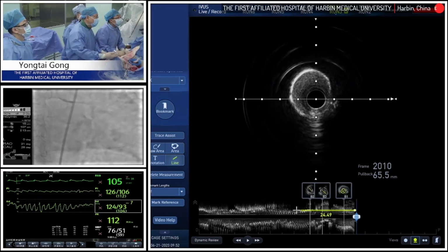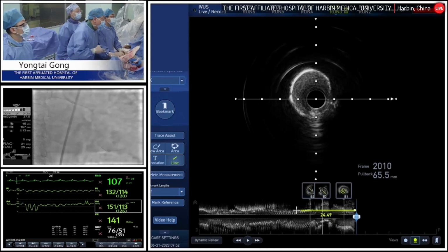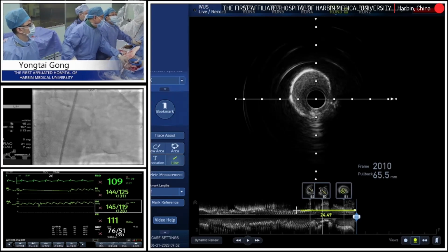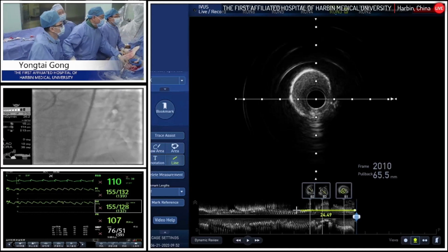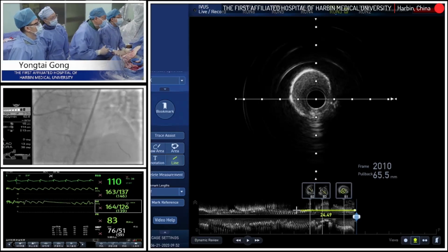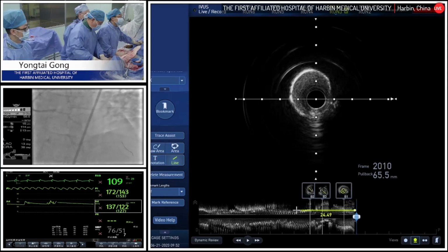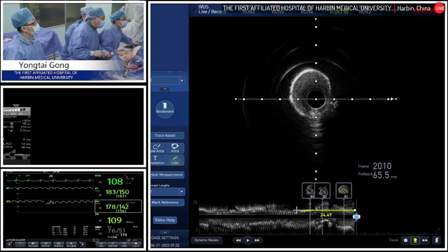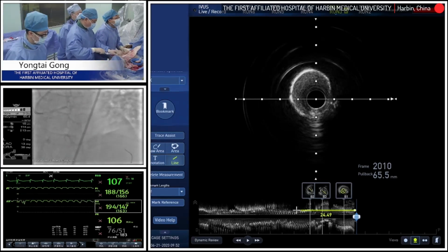Proximal positioning is enough, no need to look at the distal end, go directly into the main trunk ostium, and release it right at the ostium. Okay, I think we are trying to make some precise location of the circ. Proximal positioning is enough, no need to look at the distal end, don't squeeze too much, cover the main trunk ostium and release. Okay, we are trying to select a good projection for this patient. Can you see clearly? If not, go back, okay? Yes, 6. Okay, we are opening the stent. Okay, 6. I think that stent is well expanded. Maybe we pull back a little bit and open it again.